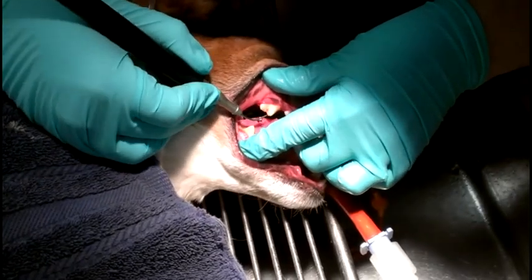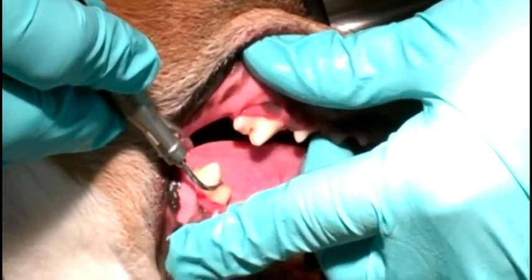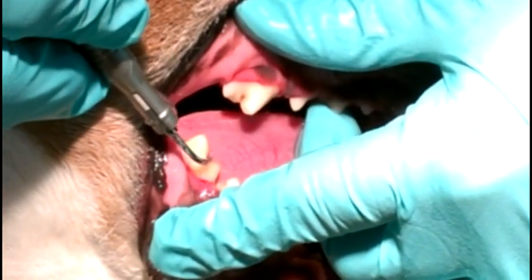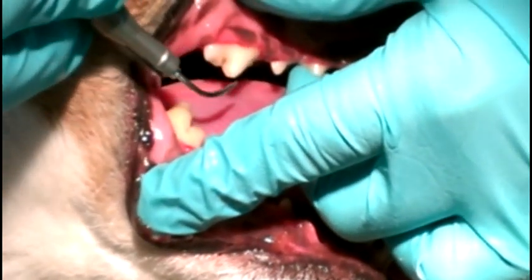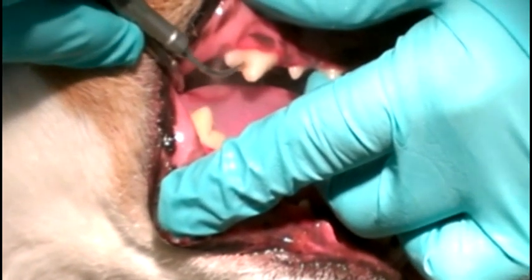Since Mabel's an older dog, you can see she has some wear and tear on these molars here. But there's no nerve showing. It's not bleeding. So it looks like they're still in good shape. It's just something that happens when they age.